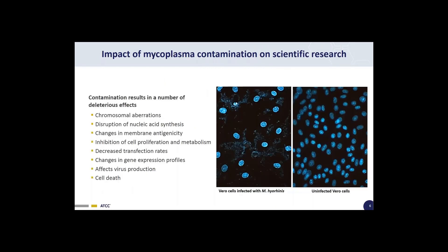What are the scientific impacts of mycoplasma contamination? Once mycoplasmas infect your culture, they compete with the host cells for nutrients, and this can cause many damaging effects. Contamination can cause chromosomal aberrations, disrupt nucleic acid synthesis, inhibit cell proliferation and metabolism, decrease transfection rates, and even cell death. Since the bacteria cannot be visualized by the naked eye or a standard microscope, these changes may go undetected for some time. As you can see in the Hoechst stain image, the small stains on the left show a mycoplasma-infected cell line, while the photo on the right shows a mycoplasma-free cell line.